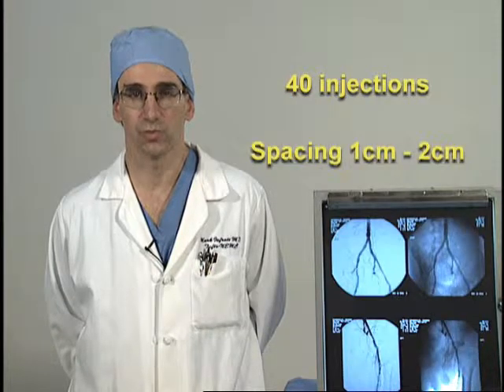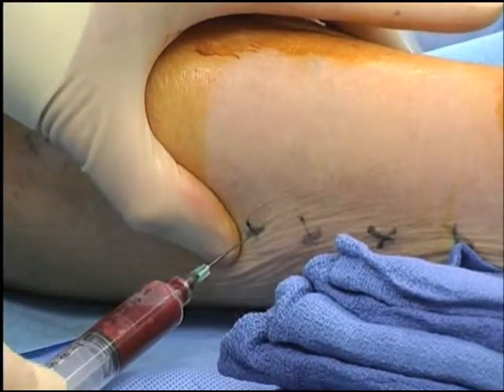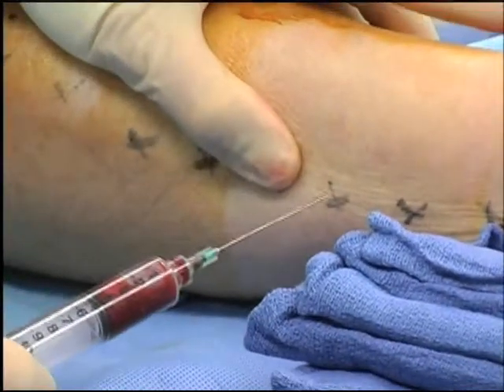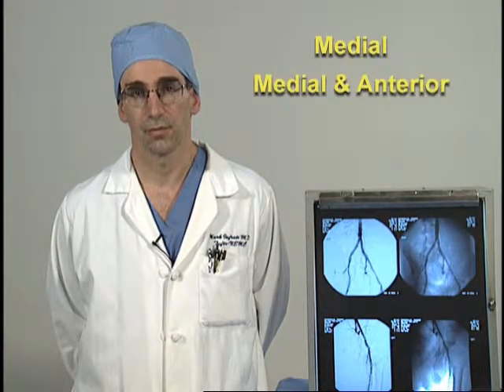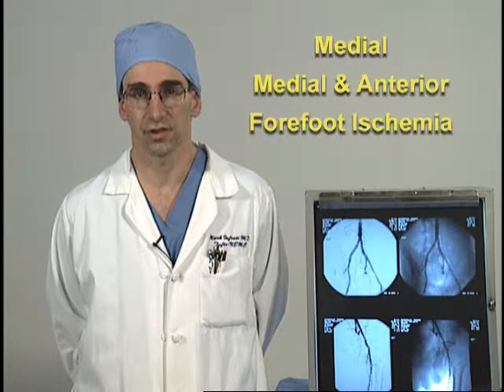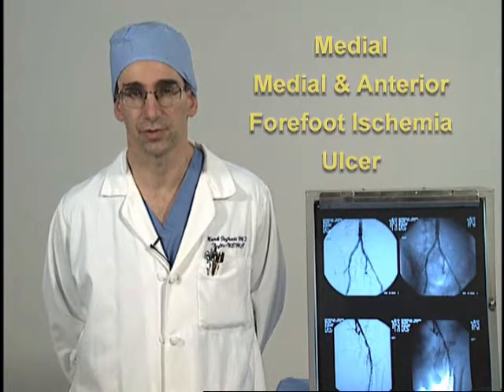The study calls for exactly 40 injections in every case at a spacing of 1 to 2 centimeters between injections. The distribution of injections can be prioritized according to the medial distribution, the anterior compartment, or based on circulation in the foot itself. The 4 cases which follow will include medial-based approaches, medial plus anterior-based approaches, and approaches that concentrate on the foot. We will also discuss how to deal with an ulcer which falls in your plane of treatment.